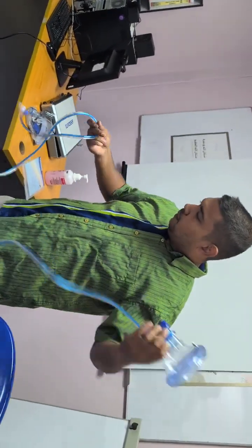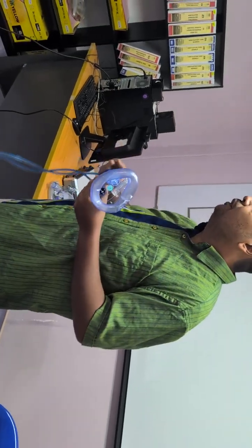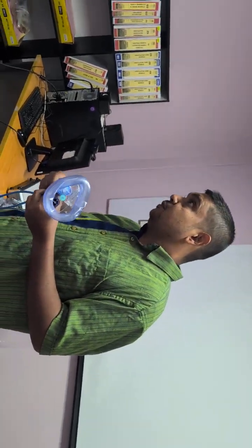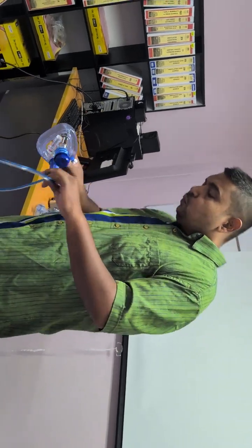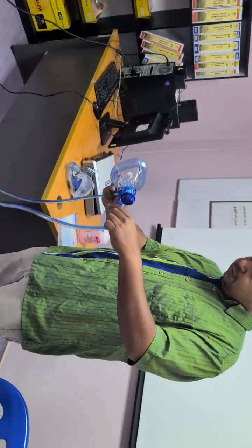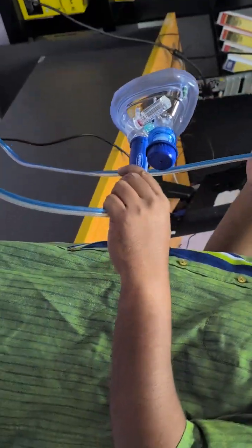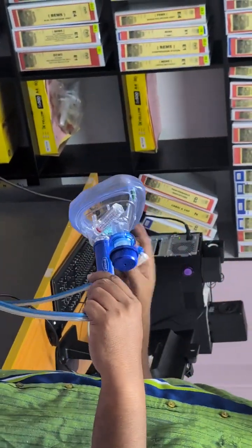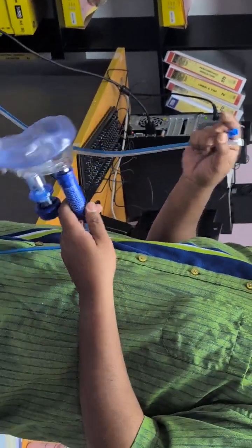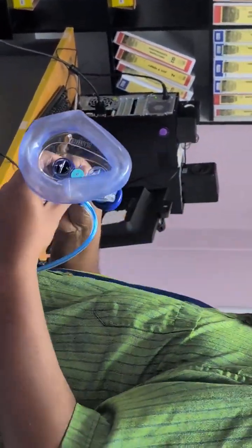This mask gives you PEEP and FiO2 as you want. It will give, at 60 liters per minute, let's say 40% FiO2 at 5 PEEP. They have already given you all the calculations.